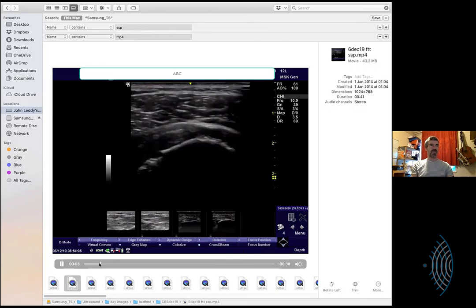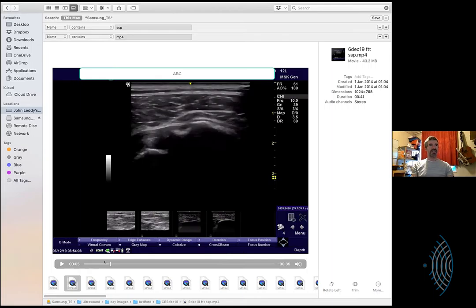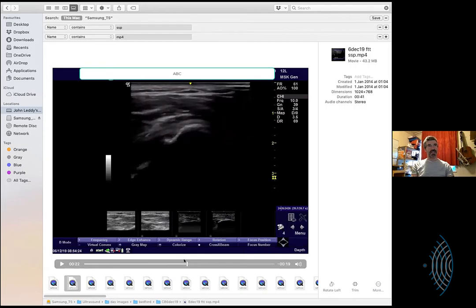Why was there such a crevasse or an impression at the start of the video? What is that? Right there. Yeah, that was the groove. That was the intertubercular groove. I got you. That's the long head of the biceps in there. All right. Yeah. So you went short axis to long axis.